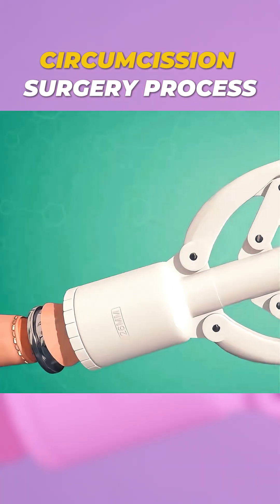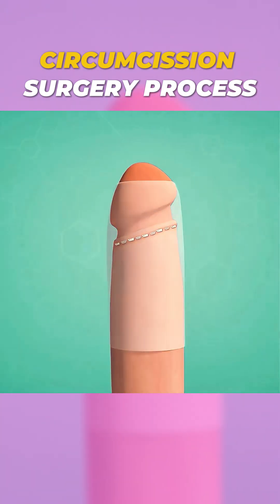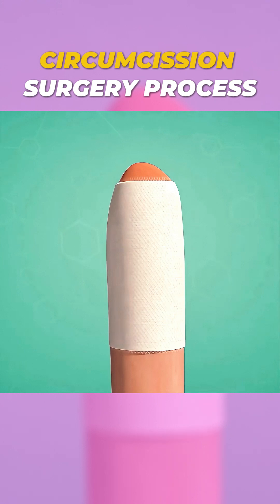Finally, the stapler is removed. The area is wrapped with dry gauze and secured with an elastic bandage. And that's how this modern tool makes the procedure quicker and safer.